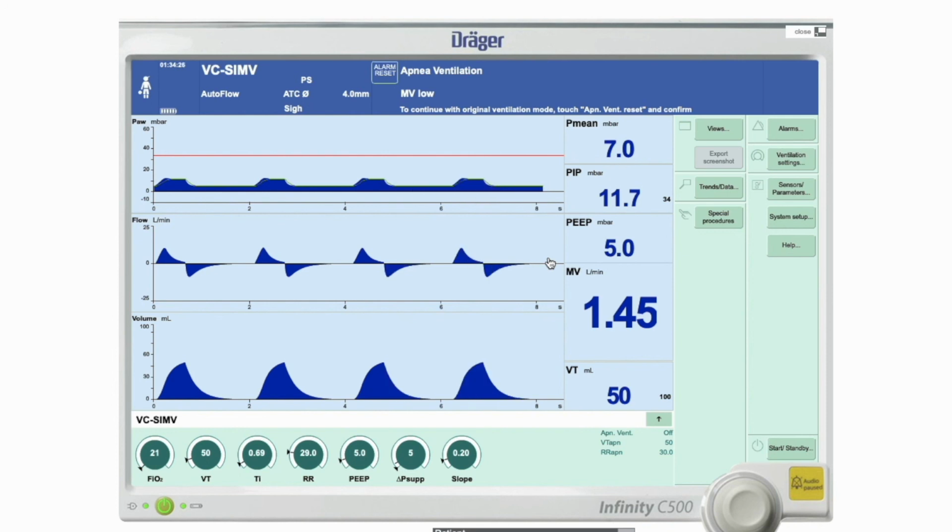So it's with any volume mode. Personally, I think if you decide to volume ventilate any patient, you should just switch it on. And it's great for when patients are getting worse. It's great for keeping CO2 the same. It's great because it will deliver the volume you've set here at the lowest possible pressure. And I did point out earlier that most volume modes have a flow button. Once you engage AutoFlow, the flow button disappears. So you have no say over the flow because the ventilator has taken that over. So it's similar to volume guarantee, and it's a very useful mode.